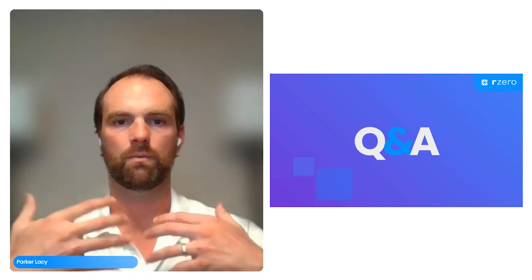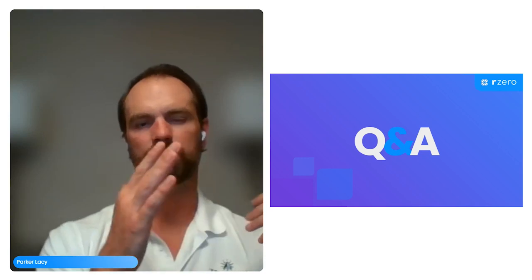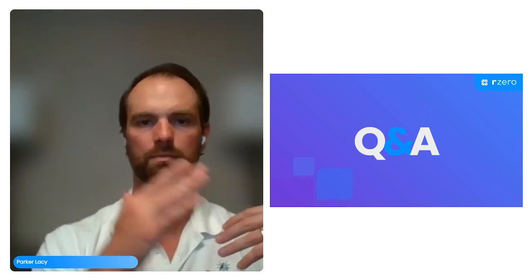That color changes as the amount of wattage that turns into joules once it's actually on the surface has been applied. When we did that, we were really looking for around 75, 80, 85 as an acceptable range, because when we looked at all the pathogens that we're really concerned about, everything really fell at a 55 mark and below in millijoules per centimeter squared required to kill it.